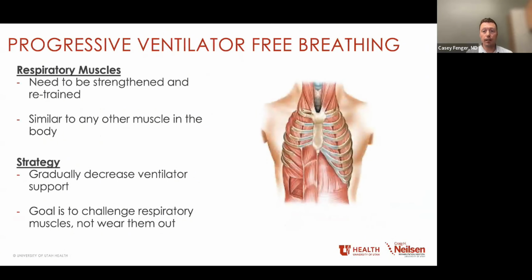So progressive ventilator-free breathing, which is a way of saying we want to progressively remove ventilatory support to train our respiratory muscles. Our respiratory muscles are similar to any other muscles in the body, right? If you don't use them, you lose them and they get weak. A lot of our patients have been on a ventilator for anywhere from 2 to 4 to 6 weeks sometimes before coming to inpatient rehab, and the respiratory muscles are atrophied.